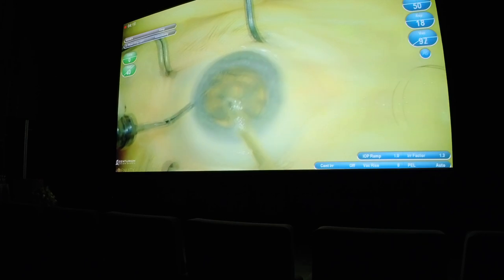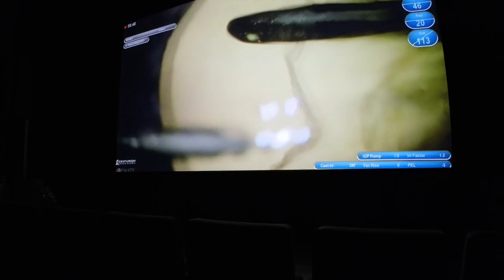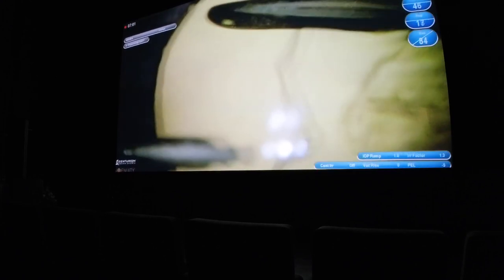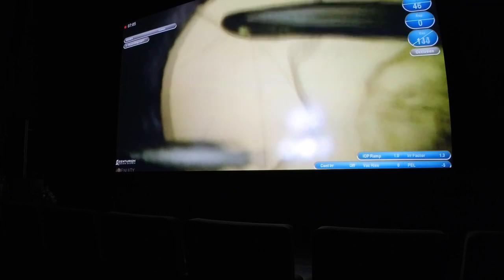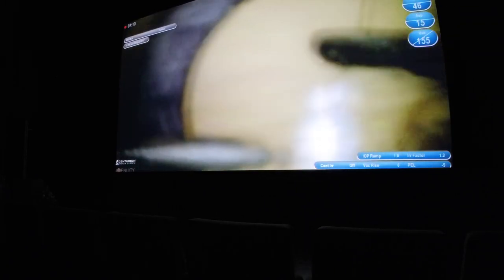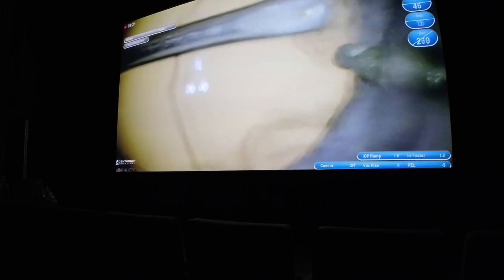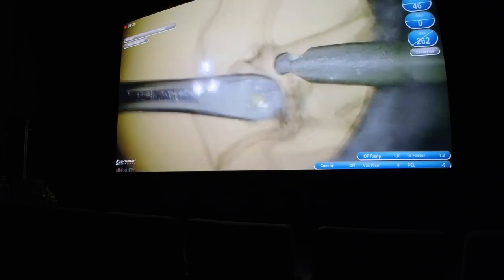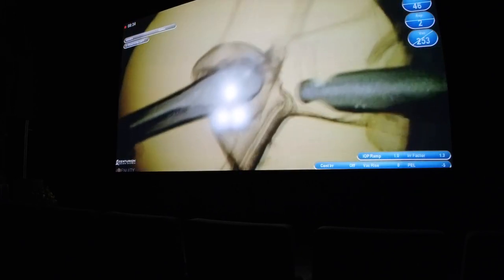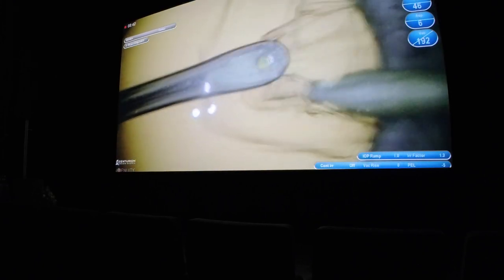All relevant parameters are on the periphery of the image, so if we need to check something, it's there. Here is an example of high magnification and also the so-called latency. Would I allow myself to play with the capsule in that way if there was a latency between the image I see and the motion I do? There is no perceivable latency in the system, which means everything happens naturally. That is why we don't use oculars anymore in our clinic. This is done on purpose — I don't work with such high magnification — but you can appreciate the quality of the image, especially with a filter applied and enhanced contrast.